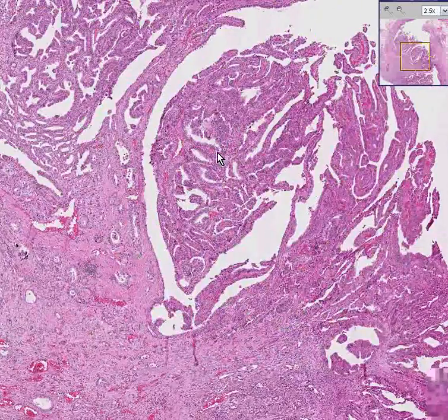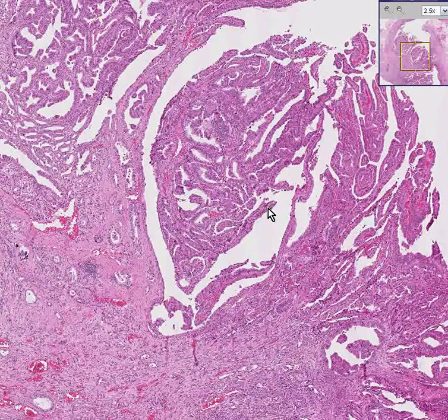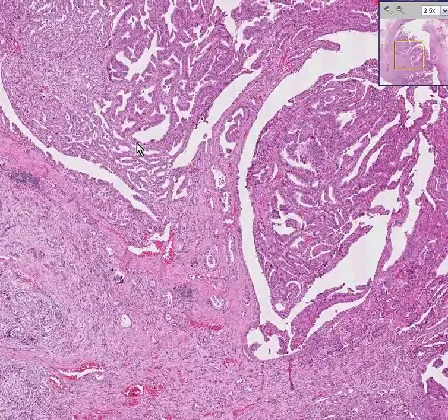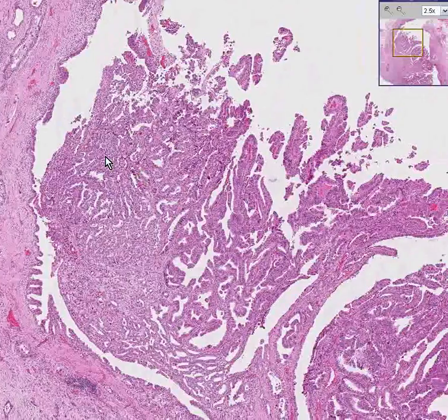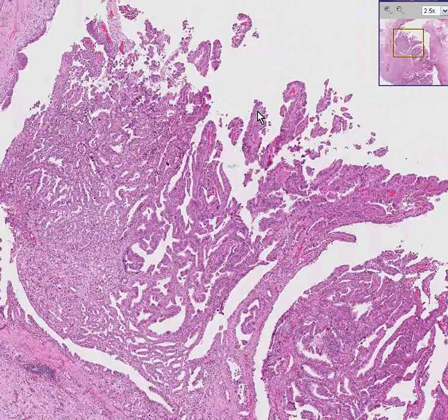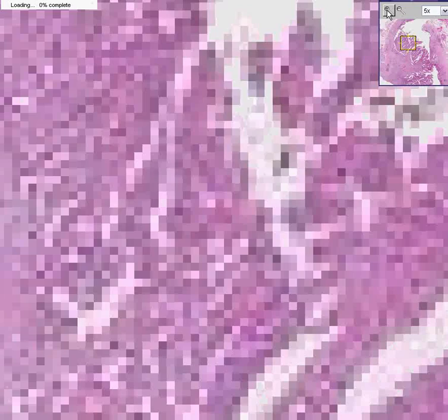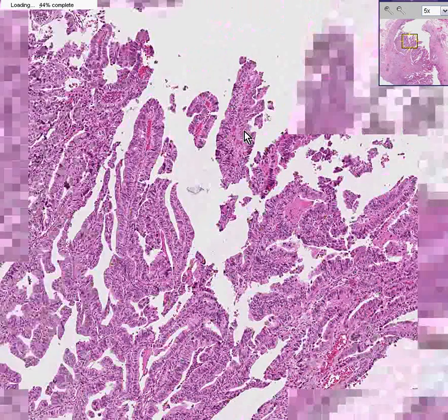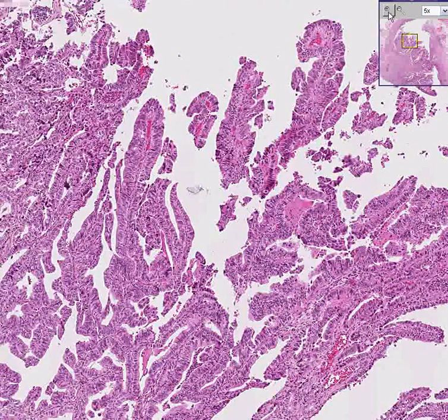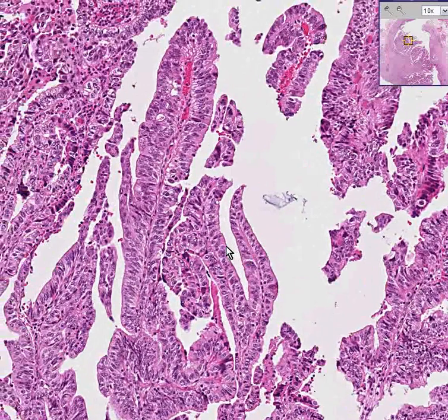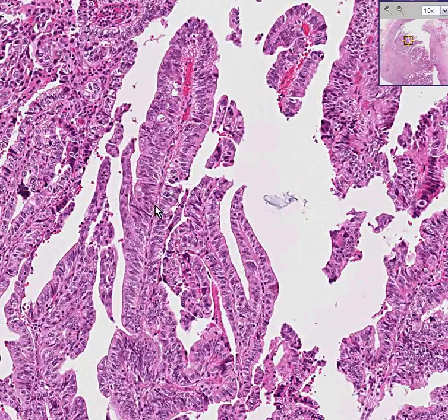This tumor may be obstructing the duct, partially or completely. If you look closely at the tumor, it appears in areas to have a papillary configuration, sending out these little fingers of tumor tissue with a central fibrous core lined peripherally by epithelium. This is a papillary cancer — a papillary adenocarcinoma arising within a common bile duct.